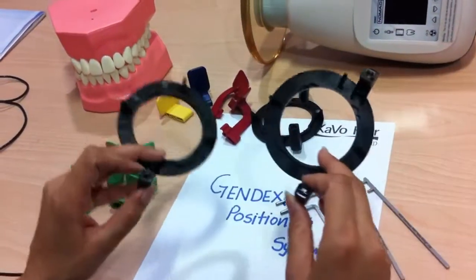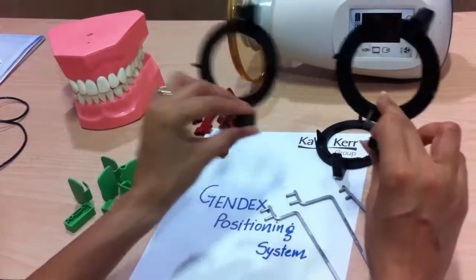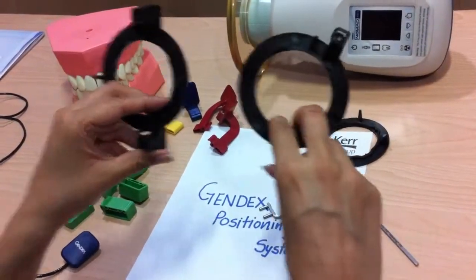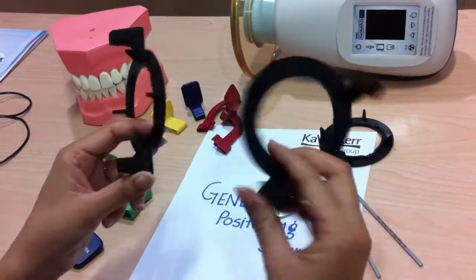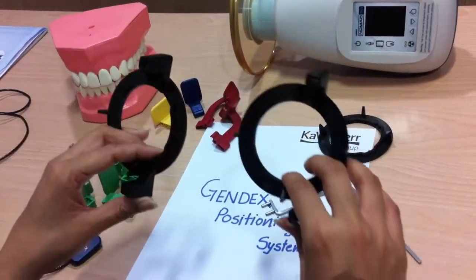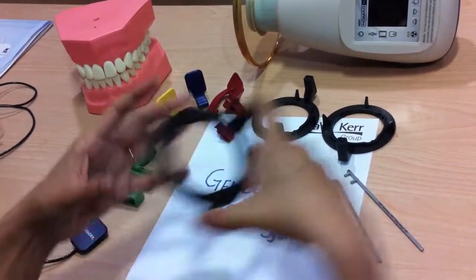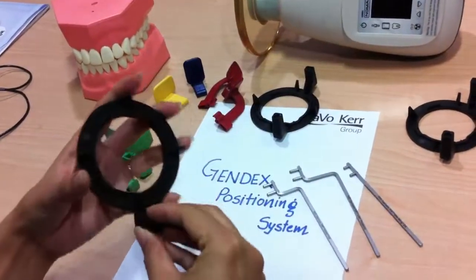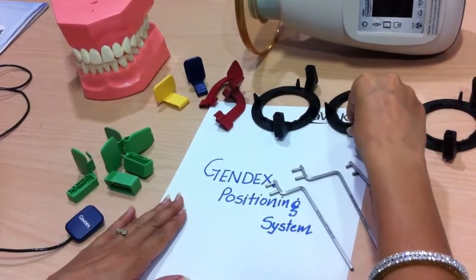You will get three rings, but two of these are similar. There is a pair of the posterior, anterior, and endo rings which have two holders for the bars. And one is for the bite-wing, which has only one holder for the bar.